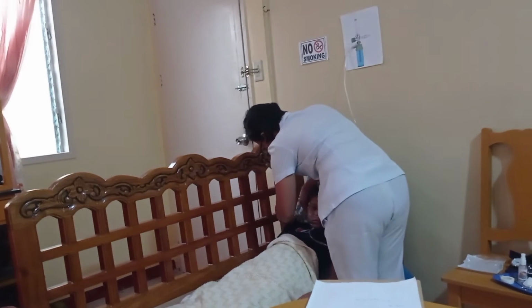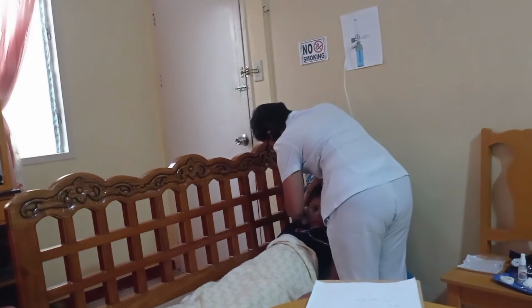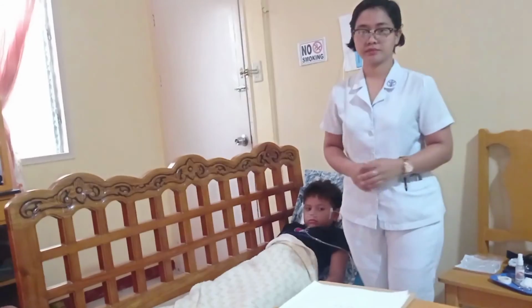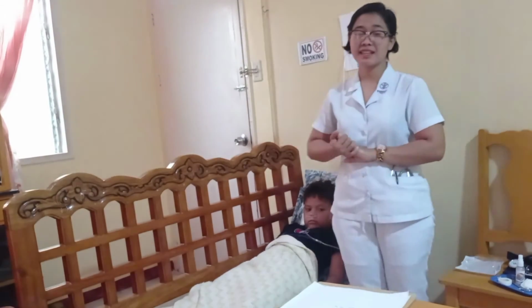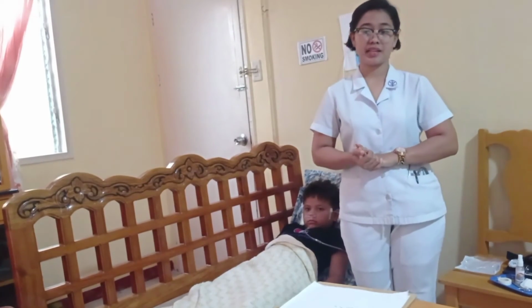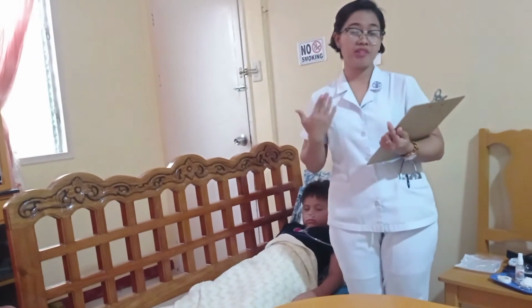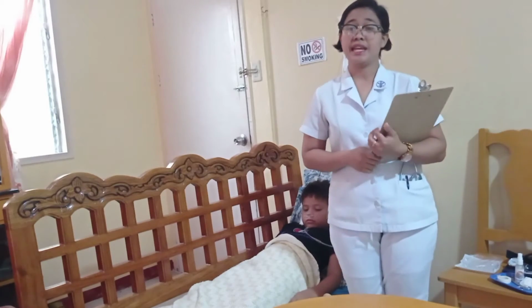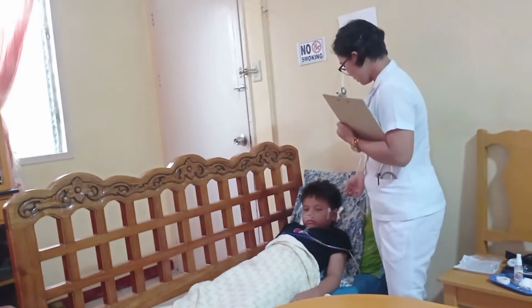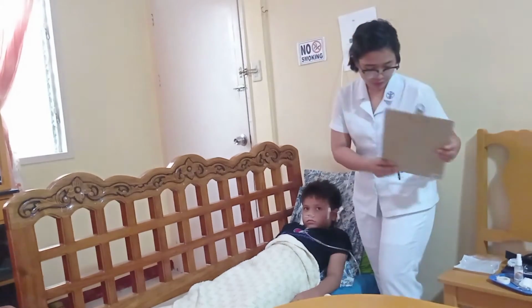And that's the vice versa. So, next, I am going to assess my client's vital signs. I am going to check for the level of anxiety, the color, the ease of respirations, and provide support while the client adjusts to the devices.